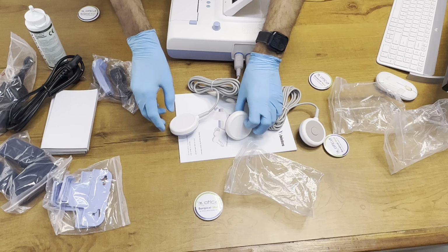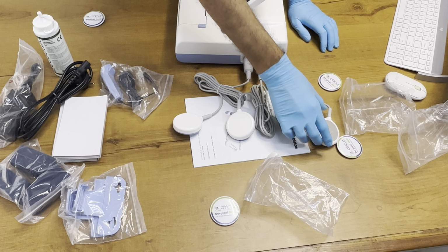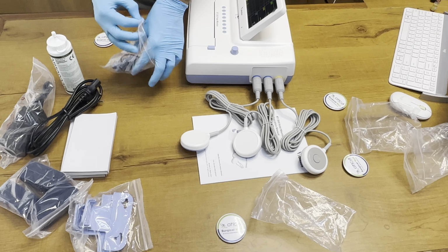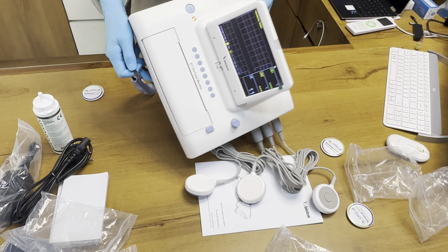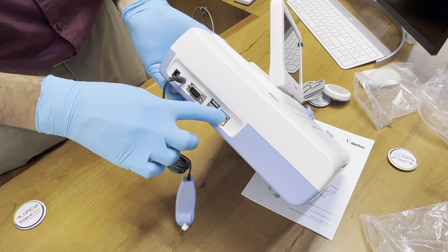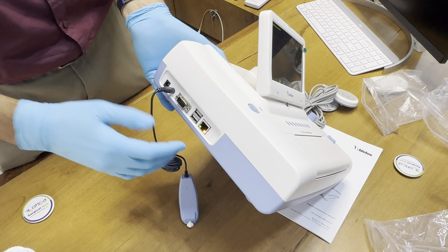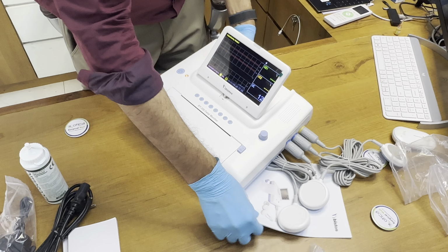Ultimately, if there is one baby in the belly, then you just need to connect one probe. You don't need to connect the other two probes. And this toco is compulsory to check the uterine contractions. This is the marker. If you want to put a mark while taking the readings, the mark probe is given here. This is the LAN connection if you want to connect it with your hospital. This is the USB interface with the machine to upgrade the software and the technical specifications.